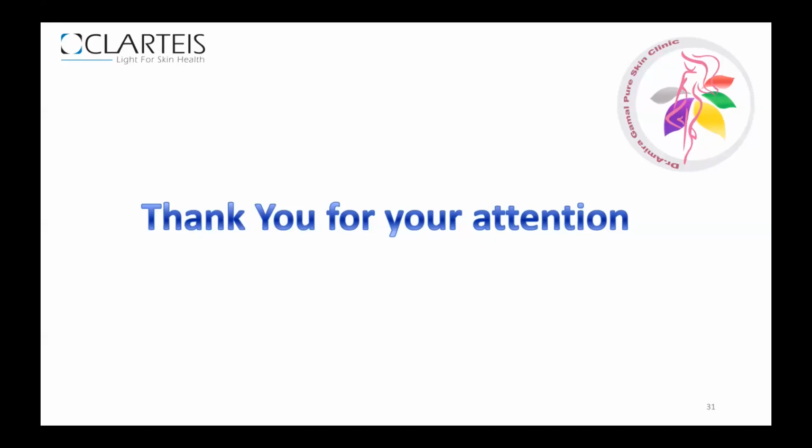The other question is regarding the maintenance sessions that you talked about at the end. One doctor is asking, what about the risk of hyperpigmentation or erythema when it comes to maintenance sessions after 1 month or 1 month and a half? No, we actually didn't see this. Even if the skin becomes normal, it doesn't make hyperpigmentation. And if you see that it makes more erythema, you can decrease the dose. It's okay if you see erythema. But actually, in psoriatic patients, they tolerate this dose even after they improve. They still tolerate this dose.